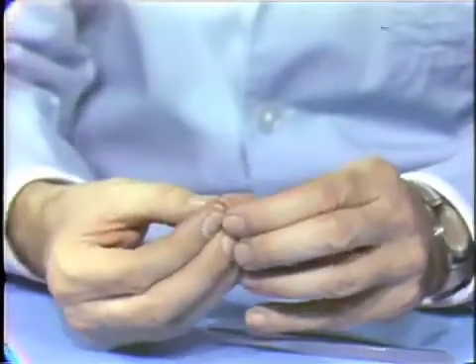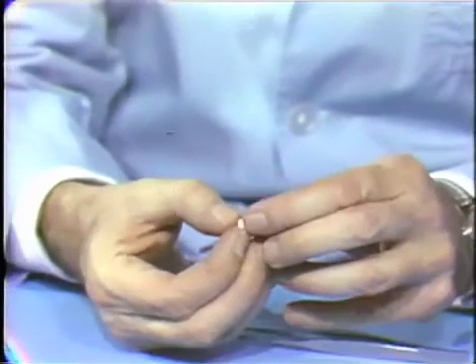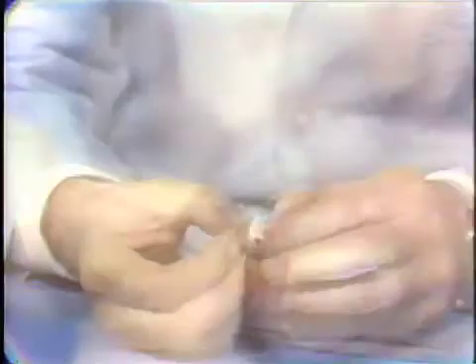Backing is returned to the facing and checked all the way around.